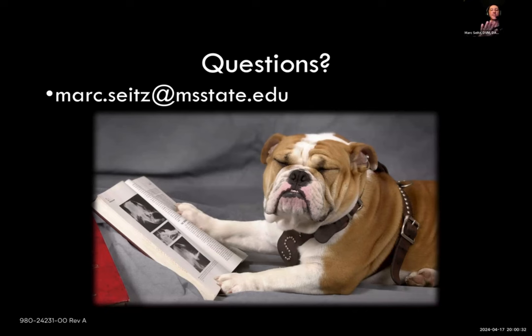Doing an imaging test in an animal that is clinical or symptomatic makes all the sense in the world. Doing it in an 8-year-old golden because it's an 8-year-old golden, you have to be real careful, because you will find abnormalities. A lot of abnormalities we find on ultrasound are not clinically significant, and they will lead to tests which spend money, waste time, and increase complications. So I will fully admit, I don't recommend this for routine geriatric screening unless there's a clinical history. If they come in for their annual and say, my pet's been more lethargic, absolutely, you should do it. But if it's an 8-year-old golden and you're just being breed racist because goldens get hemo abdomens, that's not a good reason to do it.